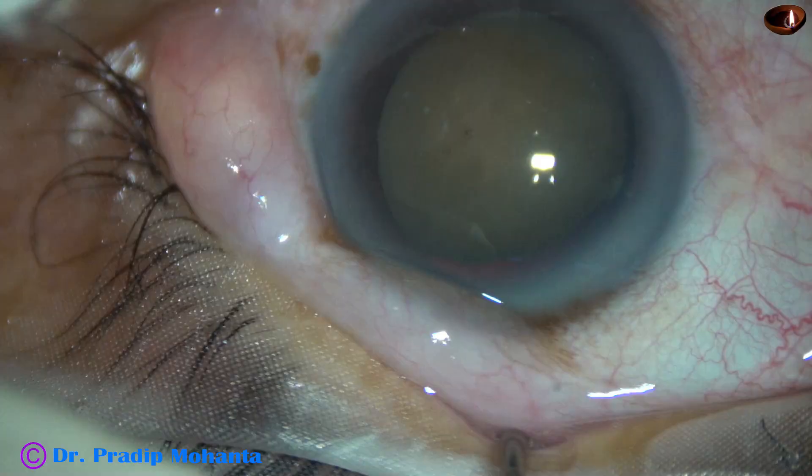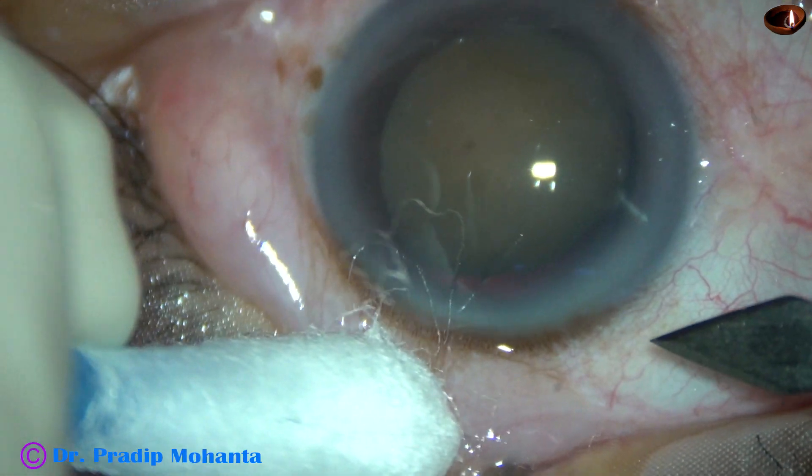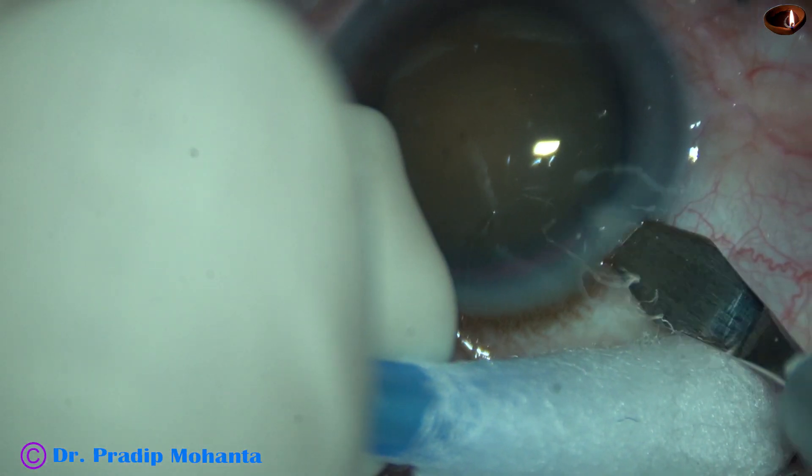Just see this very rare type of cataract. It is just the nucleus. There is no epinucleus. There is no cortex. Just the nucleus.